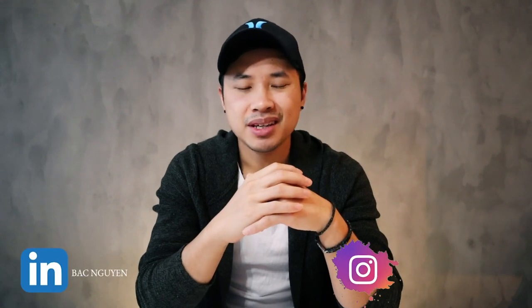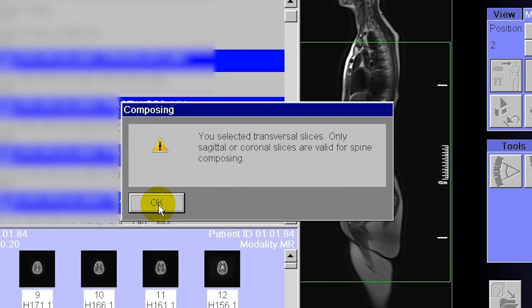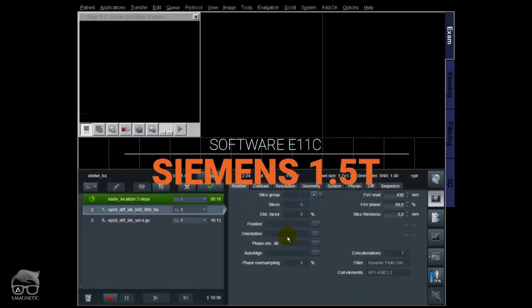Whole body diffusion is something I've been doing for a long time. I've been testing a lot of things, doing it in the transversal plane — which I'm going to show you today — and also in the coronal plane, which I can make another video about later. In this video I'm going to share how you can use the TIM planning and officially do a whole body diffusion, and if you get stuck with the pulse processing I'm also going to show you how to overcome that problem.